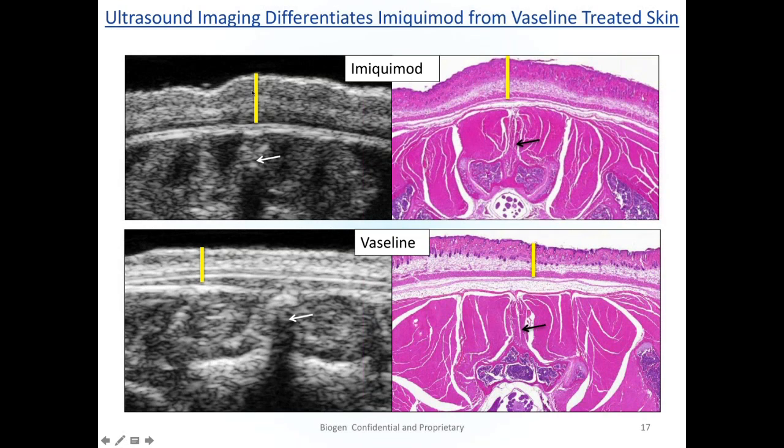So we did a lot of caliper thickness measurements here, in order to find this thickened skin layer and what's encompassed here. We did a lot of skin measurements back and forth, and then compared skin tissues in the histology.